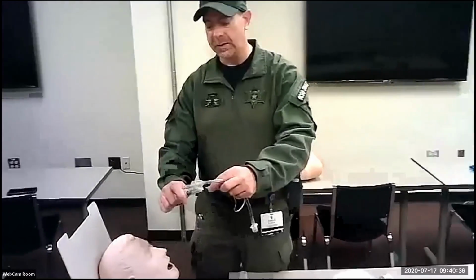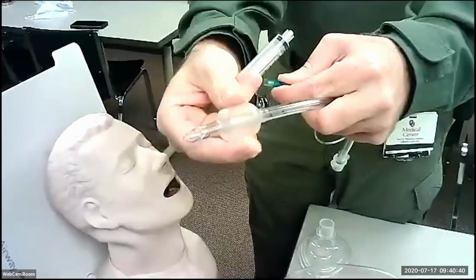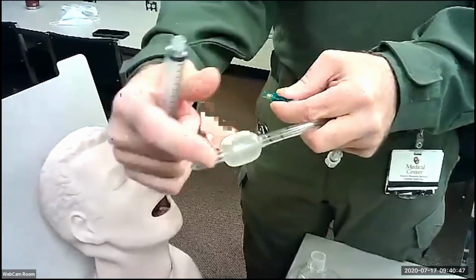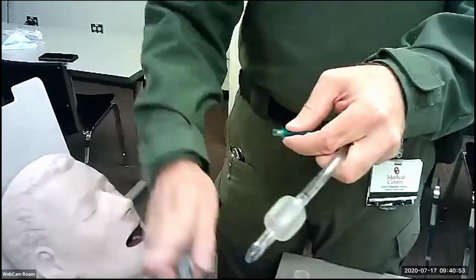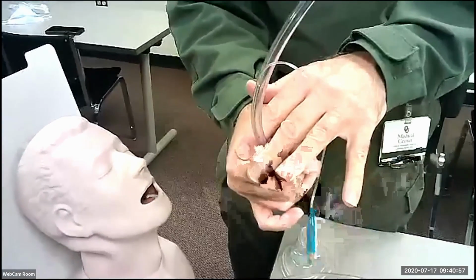Let me show you this cuff at the end of this breathing tube. Why is this important? Well, we're actually putting air through the middle of this. This seals it up against their trachea. So if they do vomit, which they will if this is a code, it's going to slide down and just sit on top of here, our trachea, and never enter their lungs.